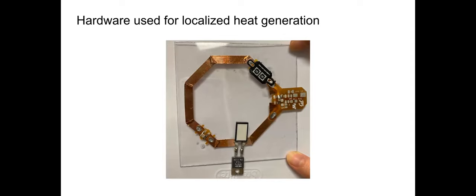Before using this method Yuhan was talking about, we at first attempted using a receiver coil. Thanks to Julian, we borrowed this coil from him. This coil was tuned to the Larmor frequency of the 3T scanner that we have. In order to reduce the heating danger, which might cause the solder joints to burn, we actually cut the traces and then placed two resistors in series with the coil in order to spoil the Q.